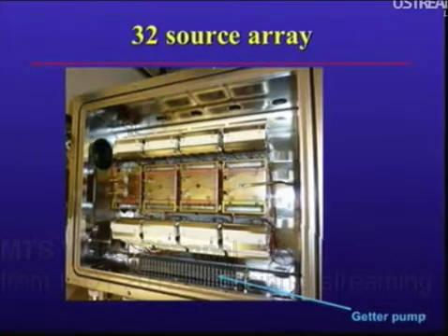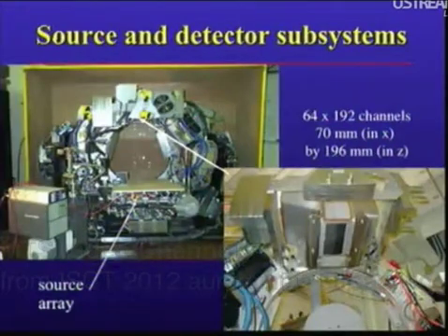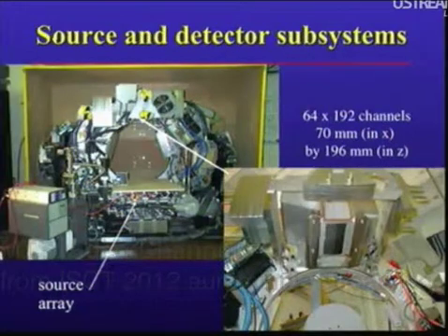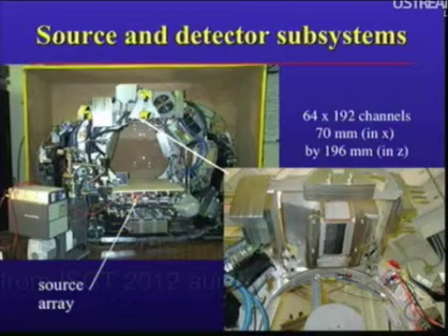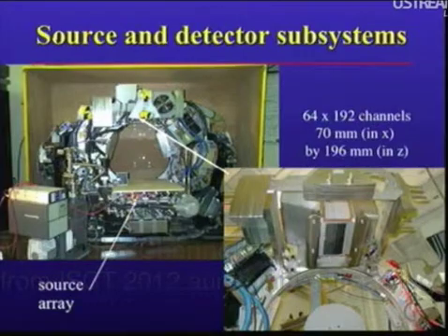Here you see the 4 modules that we now have integrated into the source array, looking into the vacuum chamber with the cover off. That, as shown there, has 32 sources in it. The detector is a lot like the conventional CT detector in this case, but turned on its side. So it's a 64 by 192 channels. It's 192 channels in the Z direction and 64 in the in-plane direction.